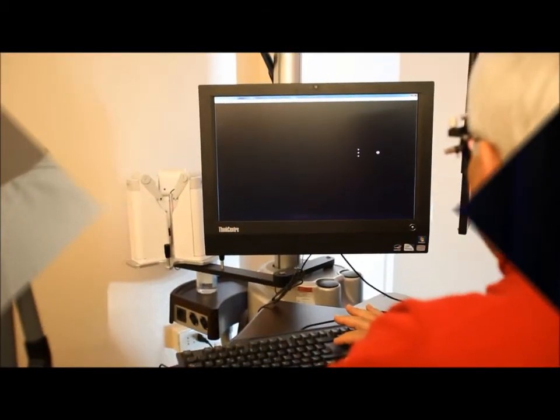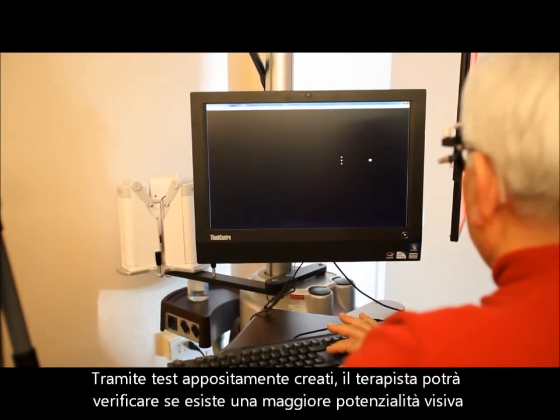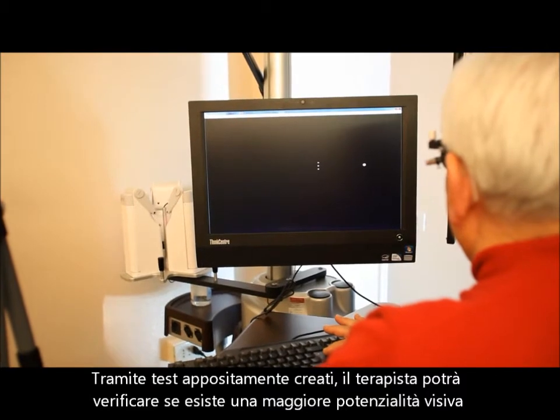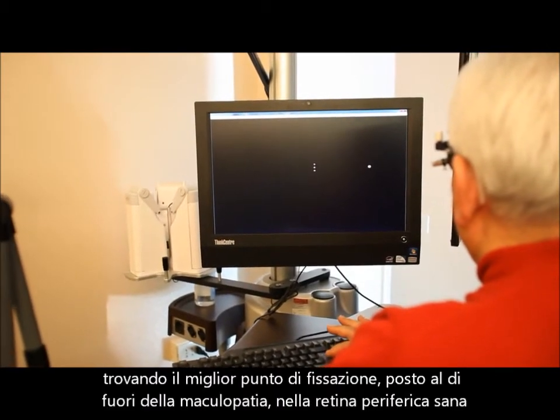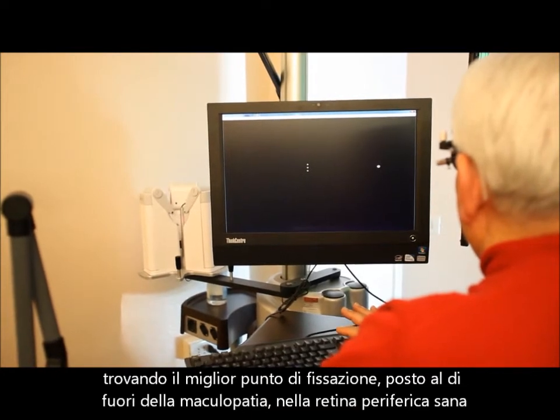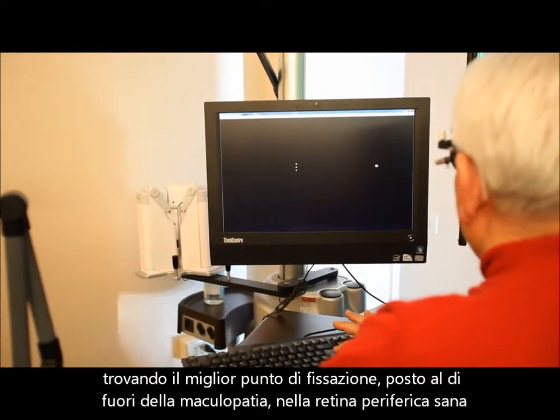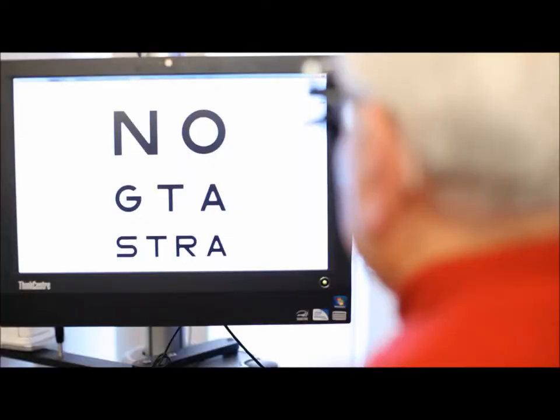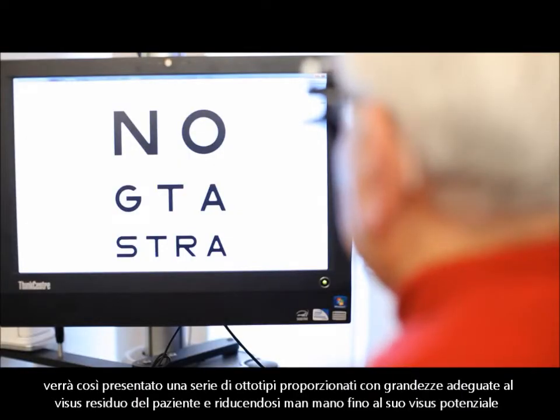The patient has placed his preferential eccentric fixation. Following this, an algorithm will automatically create a customized vision chart based on the resolution angle, knowing the location of the preferred retina locus. If the lines presented are not read to the end, the program will automatically generate a path of photostimulation targeted to achieve the predicted result.